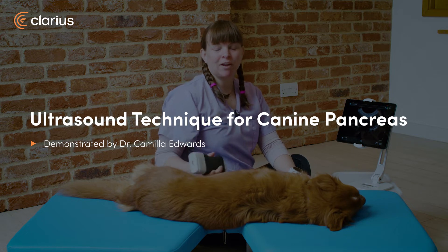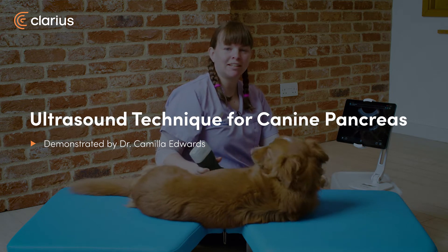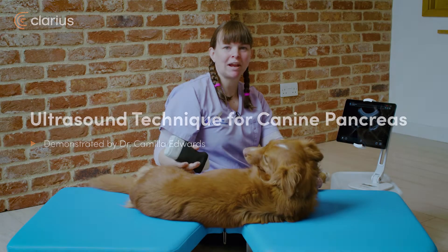Hello, I'm Dr. Camilla Edwards from First Opinion Veterinary Altsand, and today I'm going to teach you how to scan the pancreas.